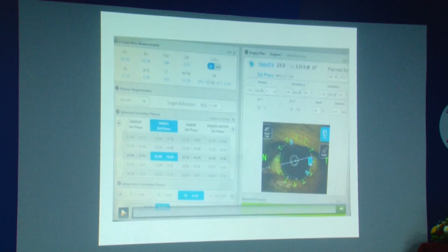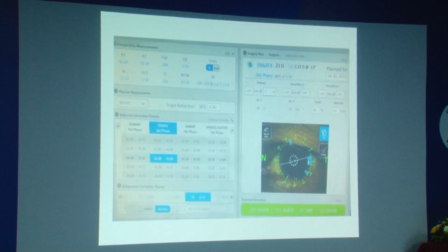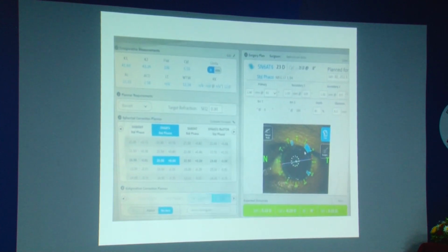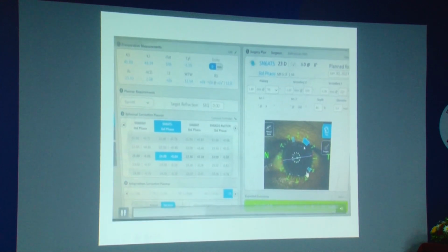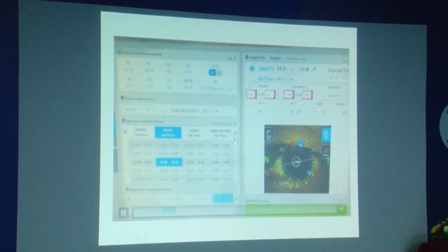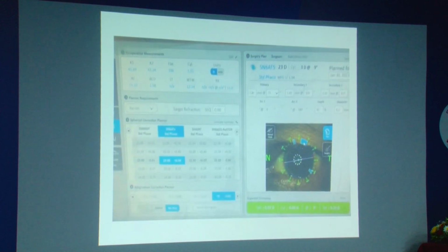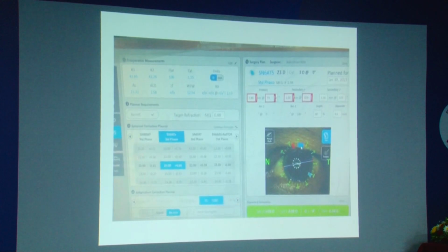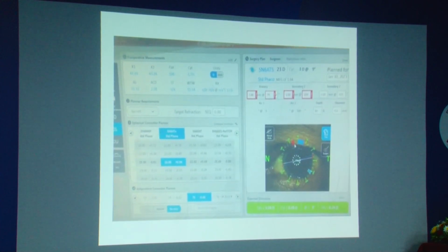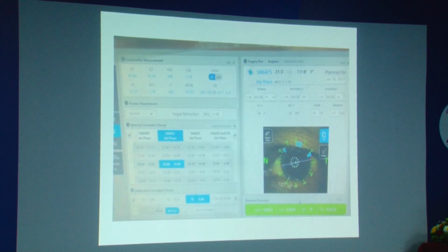Now, you can see in this particular video of a Verion planning, we are changing the position of the wound from a 0 to a superior incision, and see the residual astigmatism over here, how it is decreasing. We started off with a 0.18 of a residual cylinder, and if we do the incision, say somewhere about 90 to 95 degrees, we can reduce the residual astigmatism to almost 0 with the same model lens or a different model lens. Again, we can do this by changing the wound size.